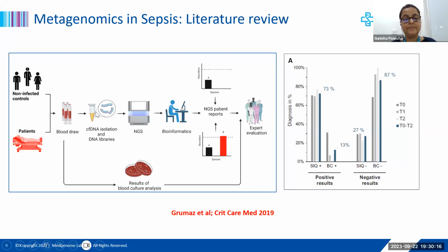The cell-free concept is very popular in cancer genomics for understanding whether cancer-causing biomarkers are present. But in terms of infectious disease, there are also specialized kits available for cell-free DNA extraction, and obviously the NGS workflow remains the same.